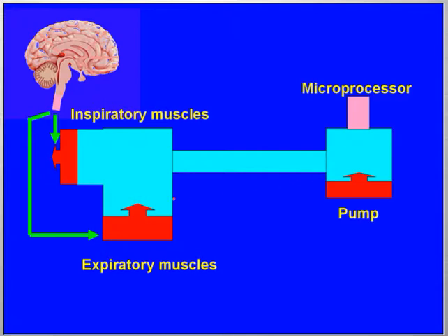And these are interacting with each other, but the complexity begins when you consider the fact that besides the brainstem, you have the cortex that is controlling breathing here and inducing variations in the breathing pattern, as opposed to just a microprocessor, which is a simple circuit performing at the level of a brainstem. And what is more is that the communication between these two systems is still the same old archaic flow and pressure-based system. And this is how mechanical ventilation was conceived, and this is how we are still continuing to do it as of today.